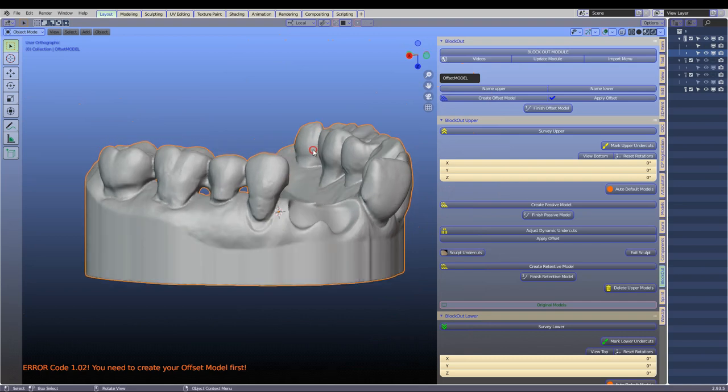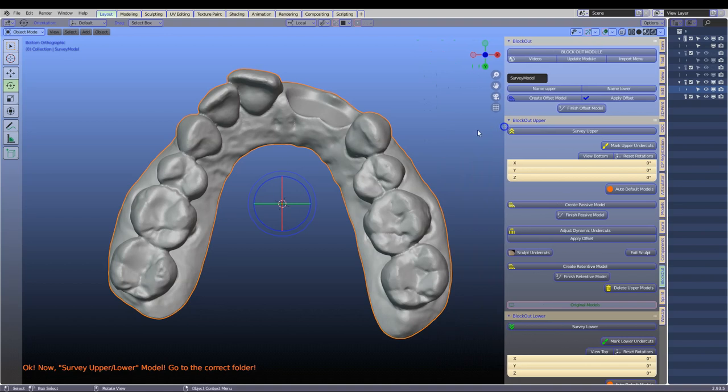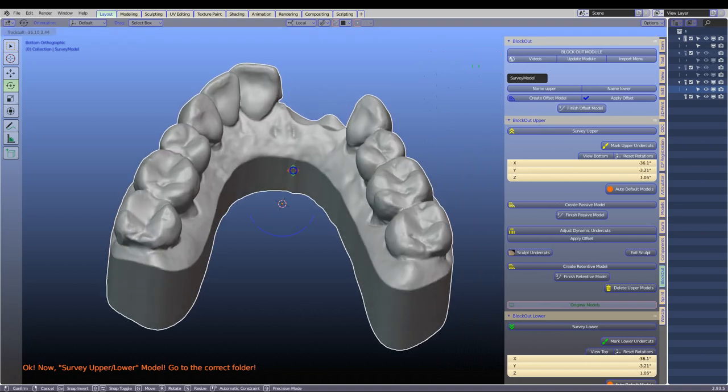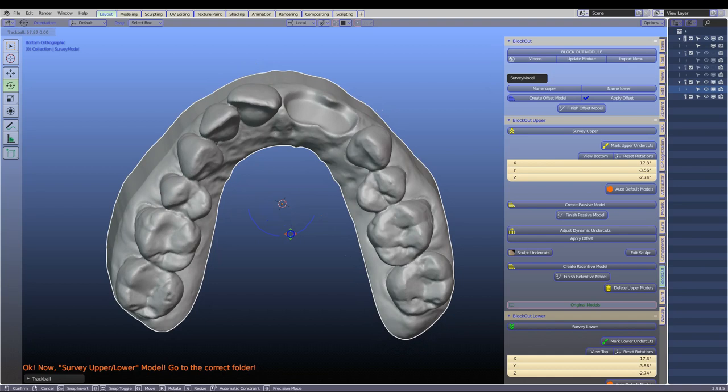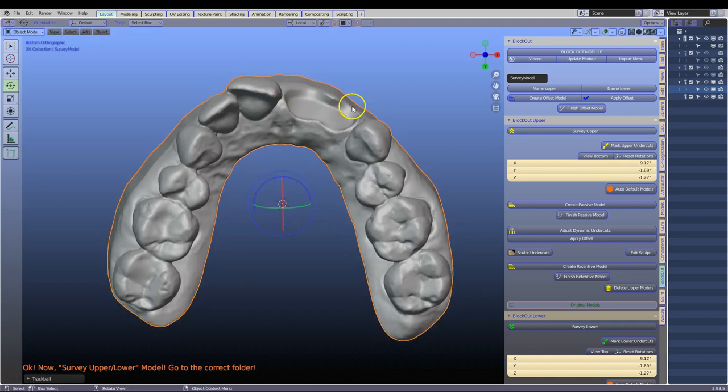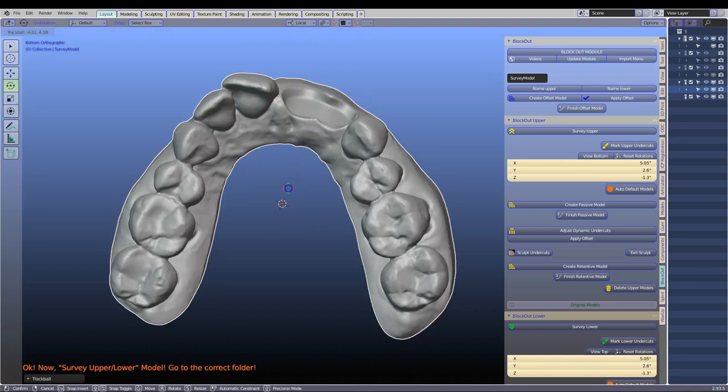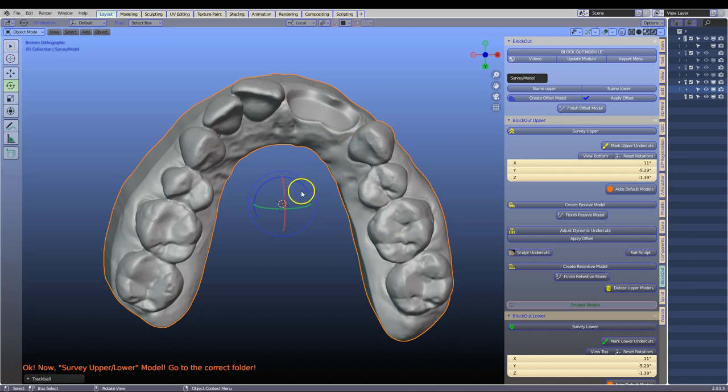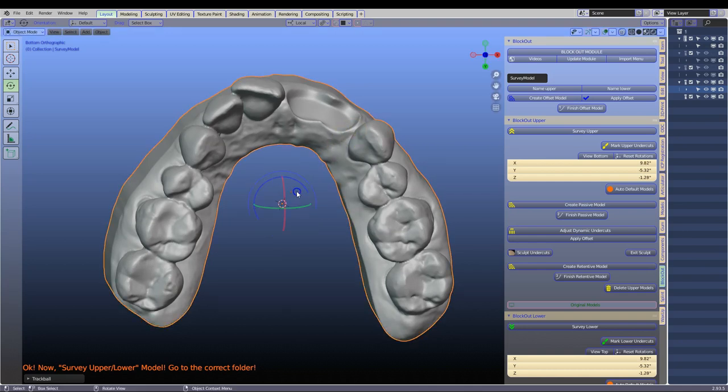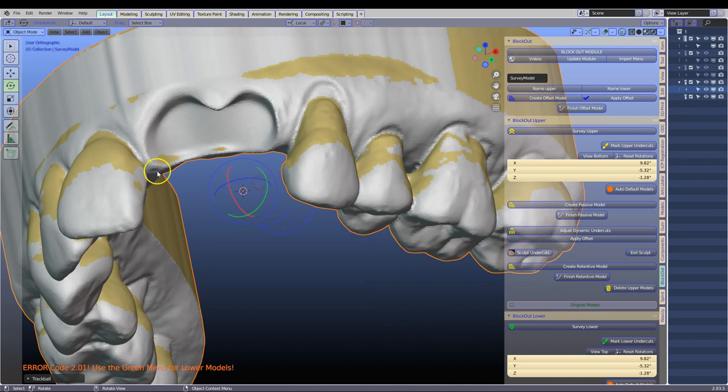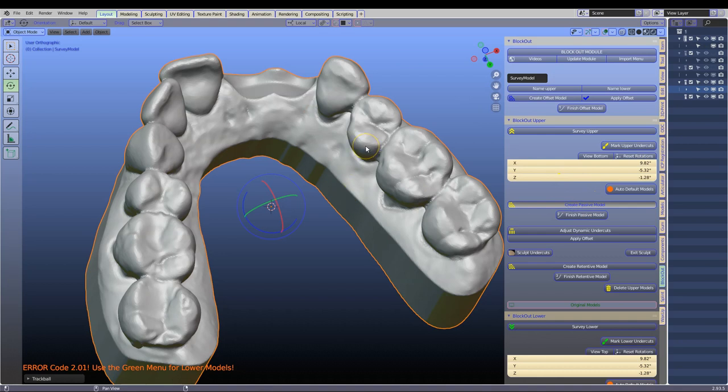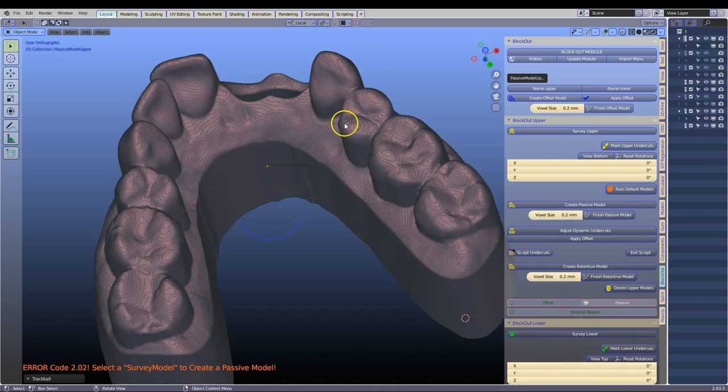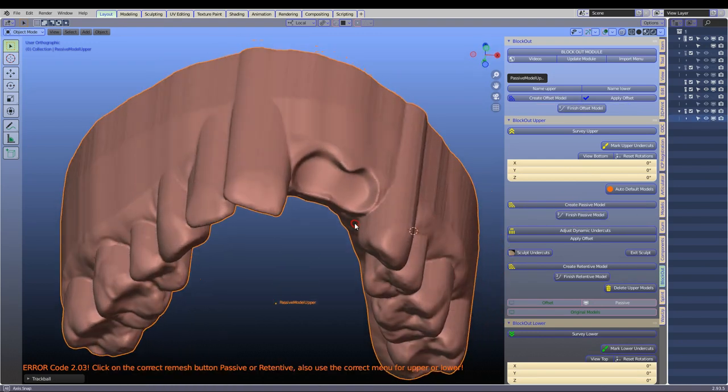Next thing is we are going to survey this. Now when we survey this we have to look at the path of insertion. So if you are inserting it from this way then the path of insertion will be blocked out differently as opposed to the top. I am blocking it out from the top because I want to maintain this tissue surface. So here what I am doing is I am looking at this side and I am looking at this side. Very important. We can mark the undercuts if you want to and here we can clearly see where the undercuts are on both sides. We are going to create a passive model. This means that all the undercuts have been blocked out. We are going to finish that.